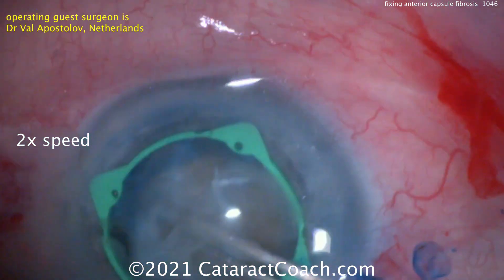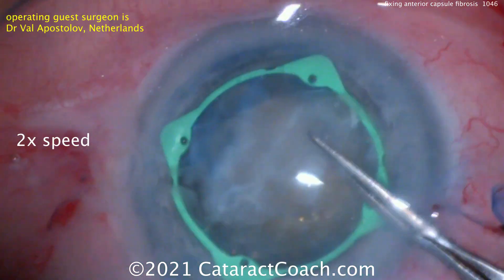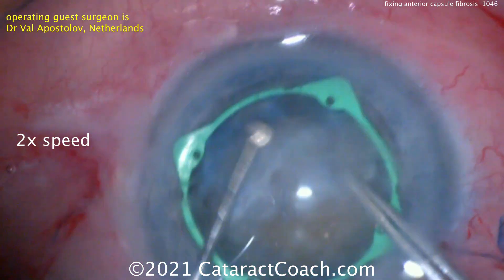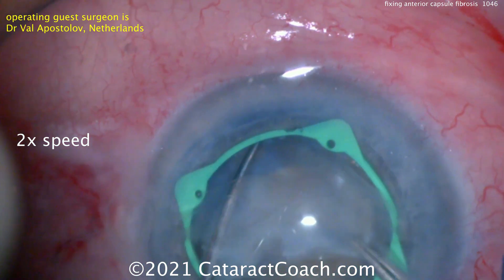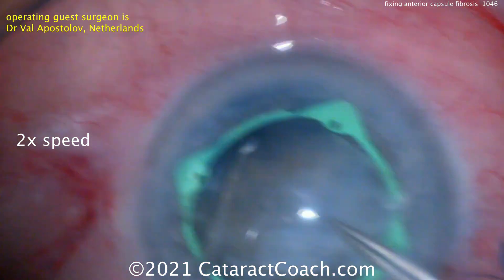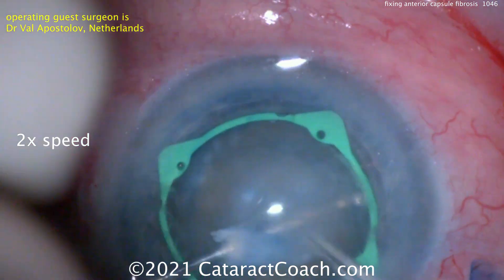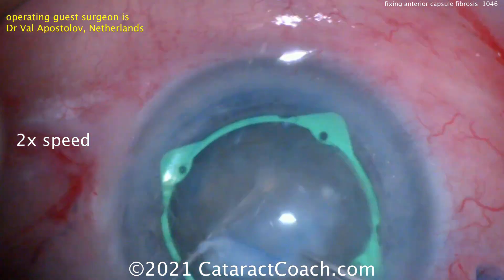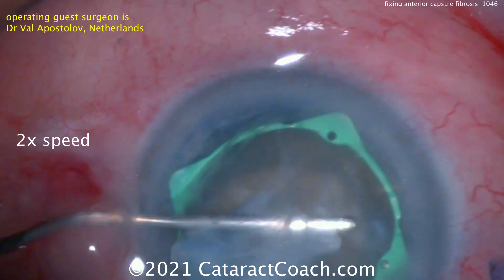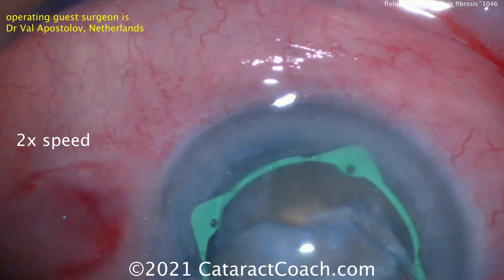That's been really nicely separated. There's a big membrane here — look at that — that's the anterior cortex, that thick fibrotic membrane. The capsule's already been opened beautifully. Now he's going to peel off that anterior cortex, which is a thick fibrotic membrane, separate it off, and then the nucleus will be home free. A different and very innovative approach than we've normally seen for these types of cases.